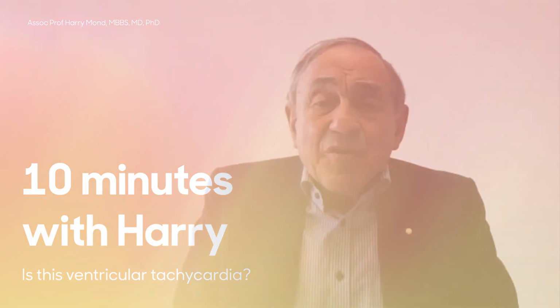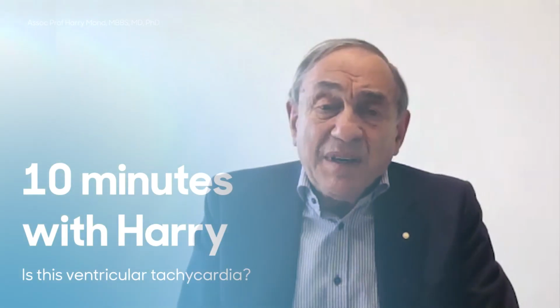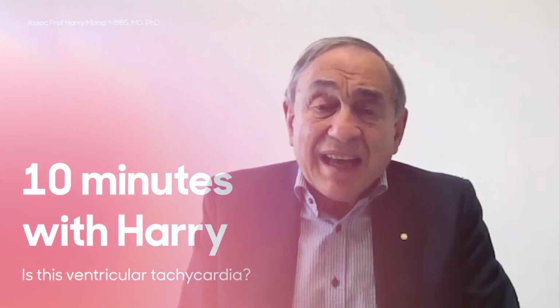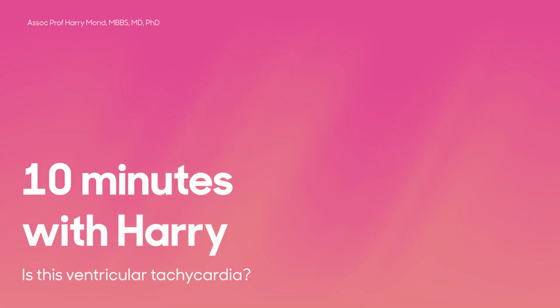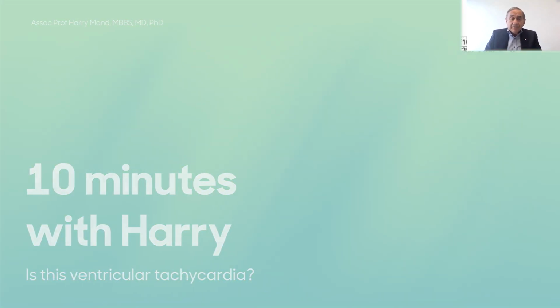Today is a very important talk as I'll be showing an electrocardiograph which is often misinterpreted and therefore may lead to unfortunate circumstances with the patient in regard to therapy. The title of my talk is "Is this ventricular tachycardia?" Let me show you the electrocardiogram.